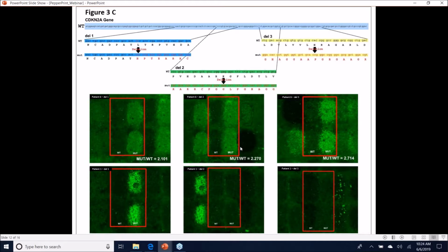The key point for us here is that just because you see a genomic mutation, you don't really know what's happening at the immunological level. And looking at the immunological level using this kind of peptide microarray provides you with another dimension of what's happening in the patient.